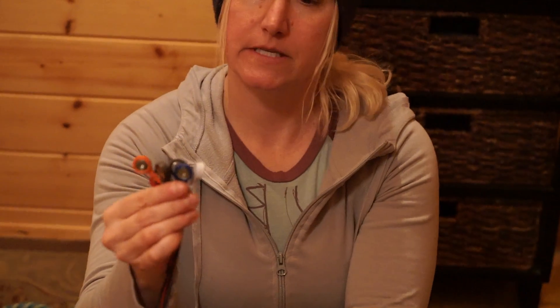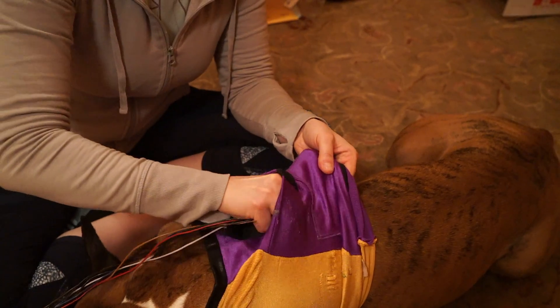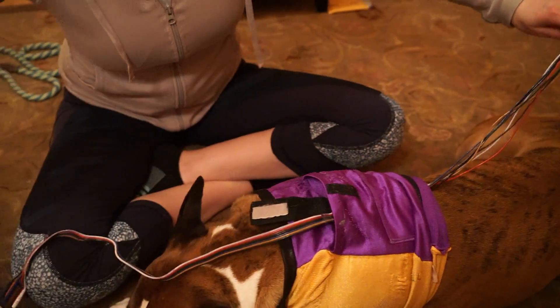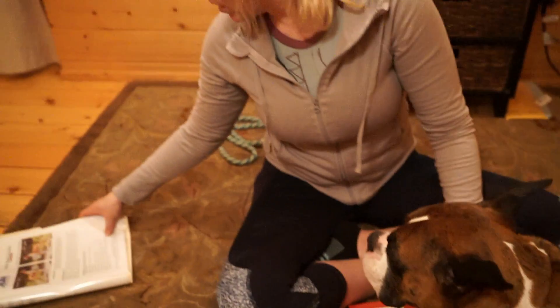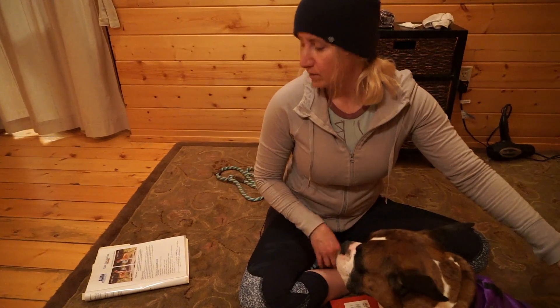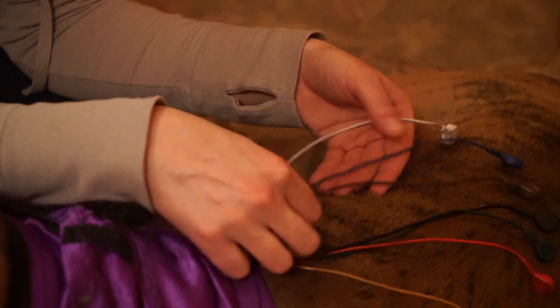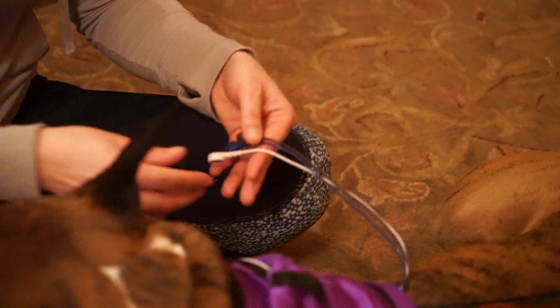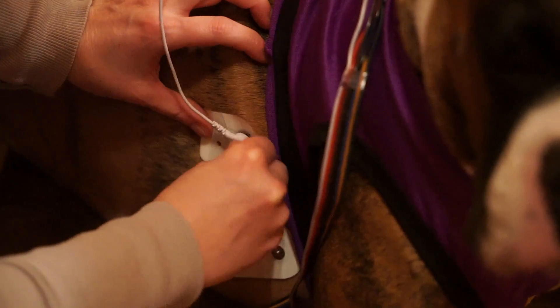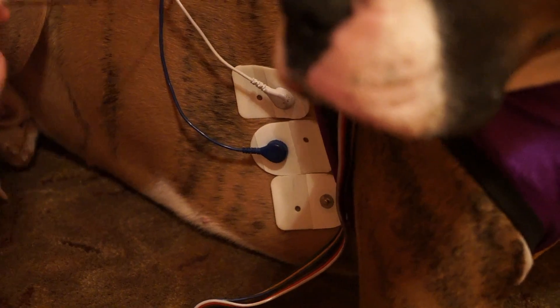So we have the recorder all set up now — it's recording, batteries in. Now we are going to take the leads and put them through this tiny little hole on Putu's coat. The right side has three leads: white, blue, and brown. So we'll take the white on the top one, then the blue one, and then the brown.